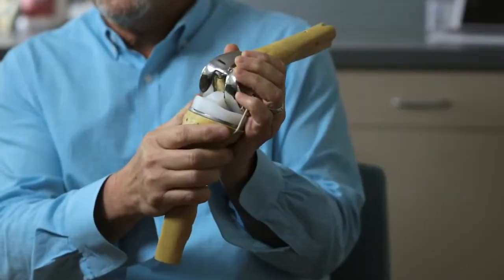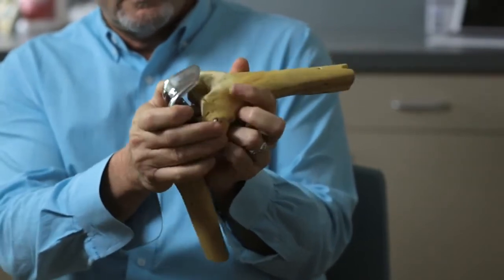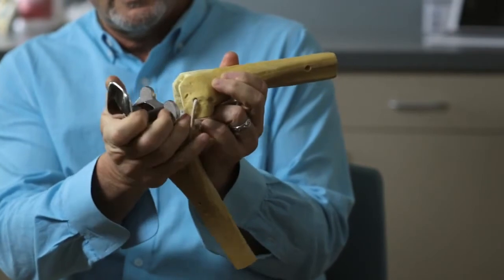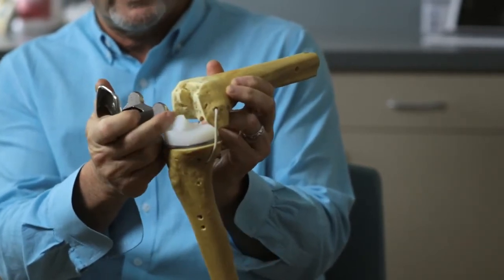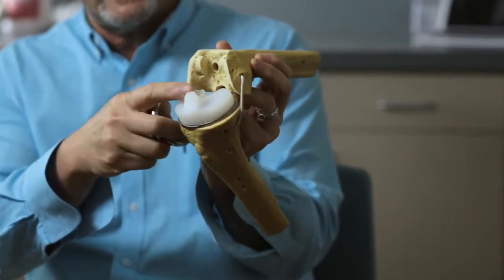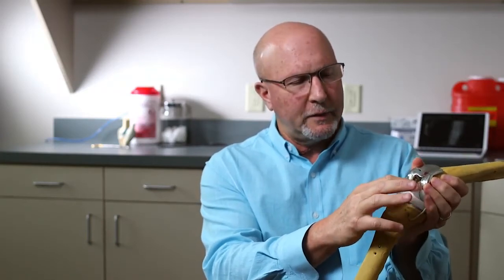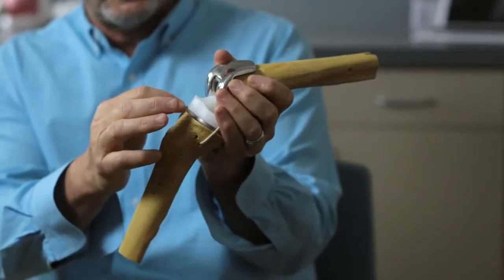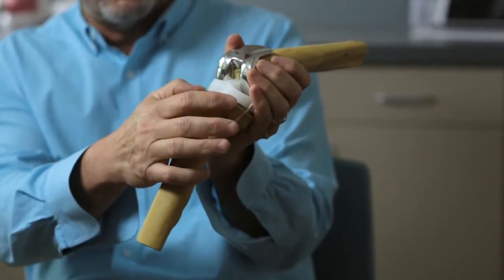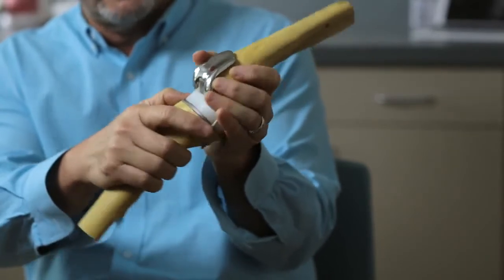This is a model of a total knee replacement, and you can see that with a long incision, the quadriceps muscle is dislocated, the patella is dislocated, and saw cuts are made to take the entire end of the bone off. A large metal component is used to resurface the bone. The anterior and posterior cruciate ligaments in here are removed as we saw off the entire top of the lower bone, put a metal plate in and a piece of plastic in.